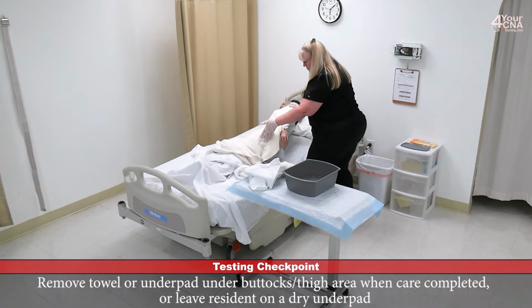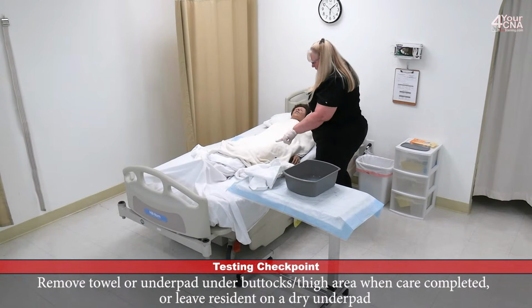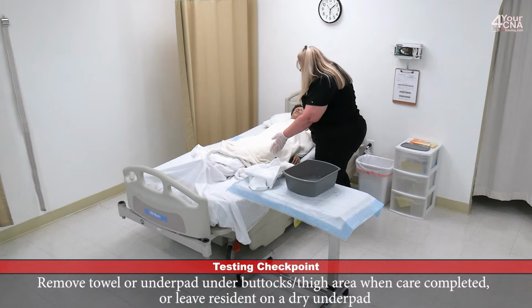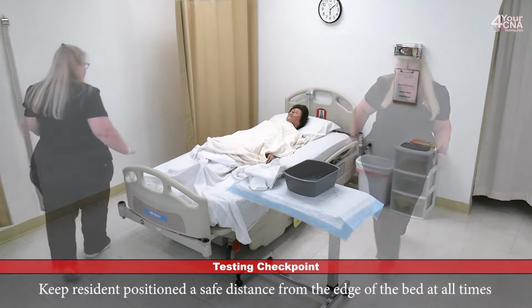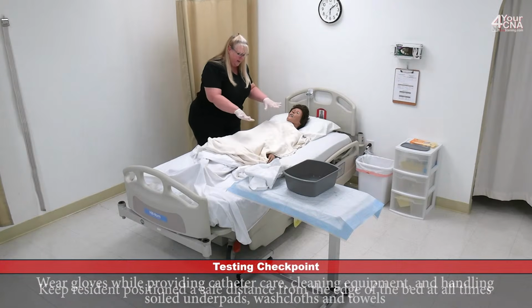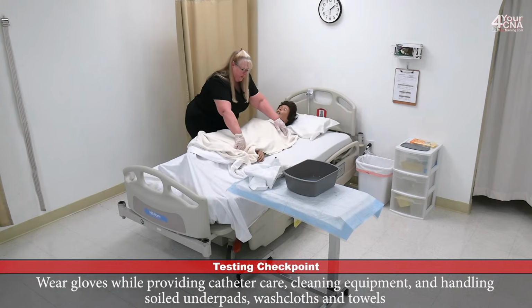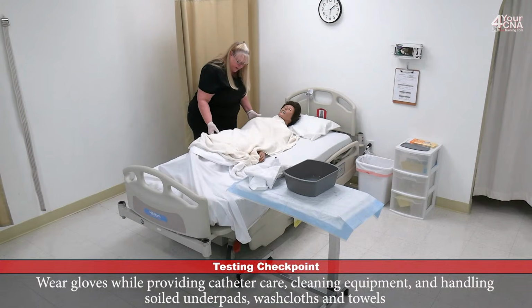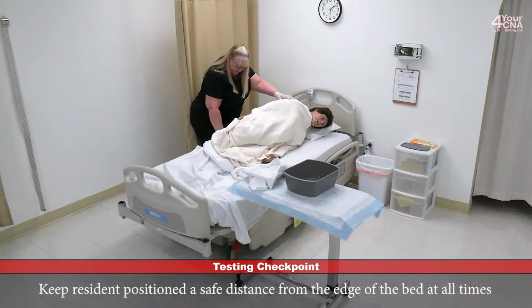Come on back, Miss Jones. When I'm moving Mrs. Jones, because my gloves are soiled, I'm only touching the outside of the privacy blanket. Mrs. Jones, scoot to the middle of the bed, please. And now we can remove your chucks. If you can scoot toward me, again, my soiled gloves are only going to touch the outside of the blanket. And then you're going to roll up on your side, 1, 2, 3. And I'll remove that chucks from under the patient.